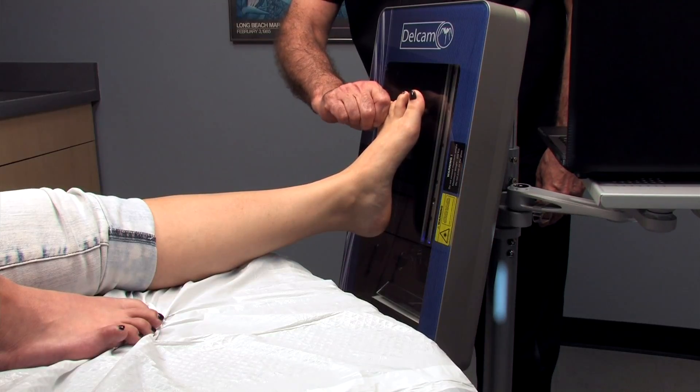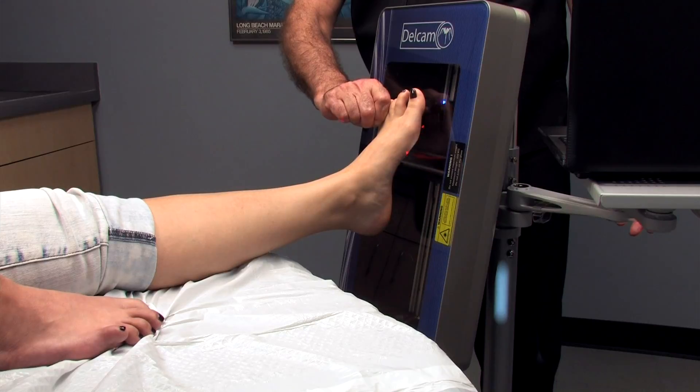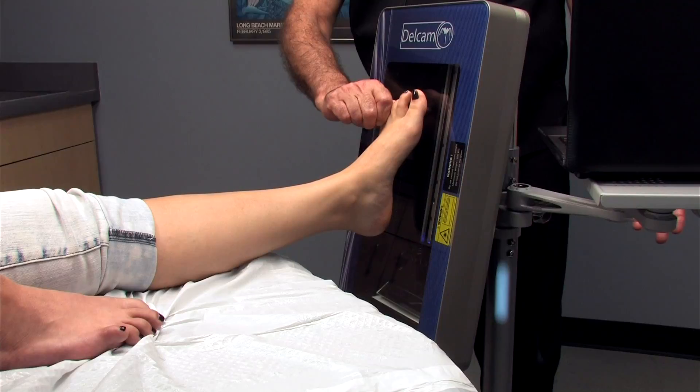With the foot properly positioned like this, we just simply hit the touch pad on the computer and the scan begins. Literally in a matter of seconds, the device captures the image of the foot and you're finished.